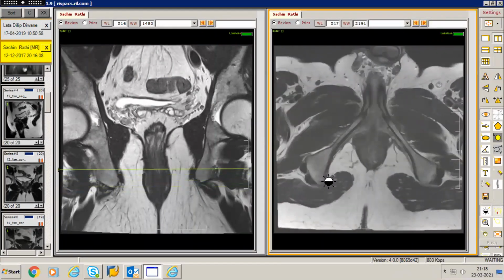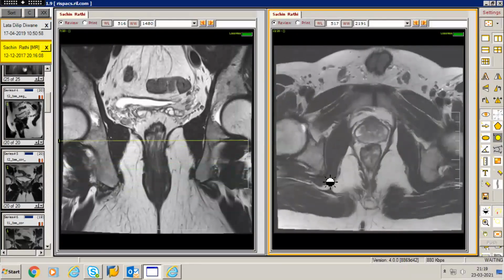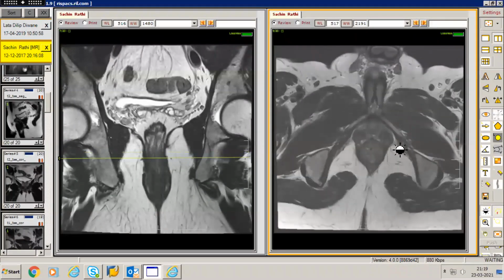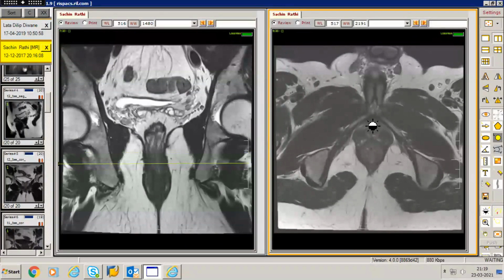As we go higher up and try to look at the same levator ani muscle components, you can still appreciate the sling-like structure coming over here. From anterior to posterior, all of us are familiar now. We are at the level of the prostate. This is the rectum over here. This would be referred to as the subpubic arch. You would have the pubococcygeus muscle, which is located at this particular location. And lower down, we're coming along into the bulb of the penis.